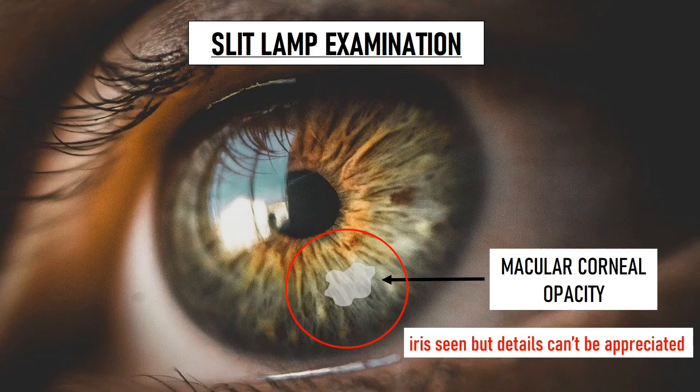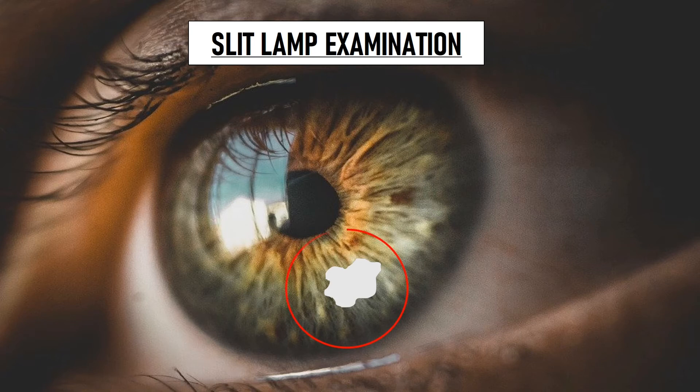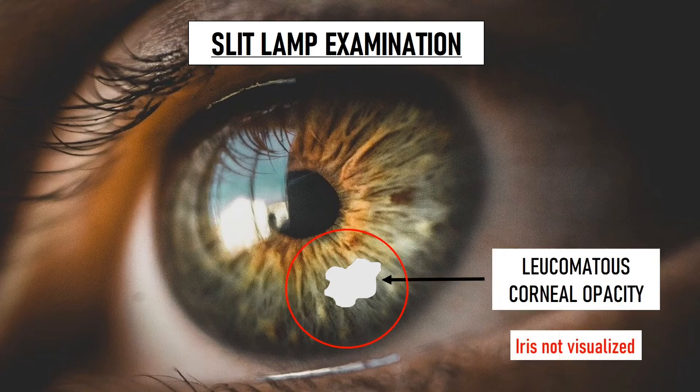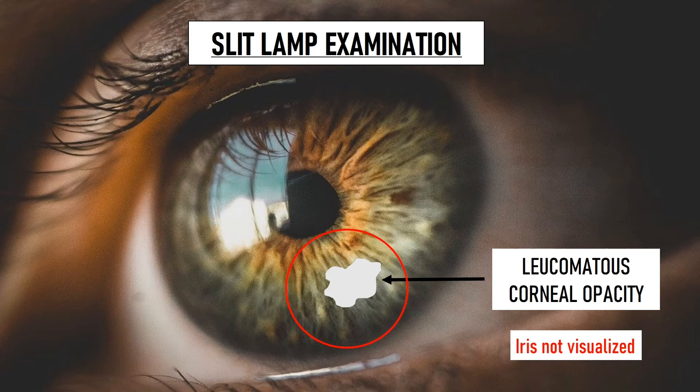Leucomatous corneal opacities are very dense and do not allow light to pass through them at all. So on slit lamp examination, the iris behind them cannot be visualized.